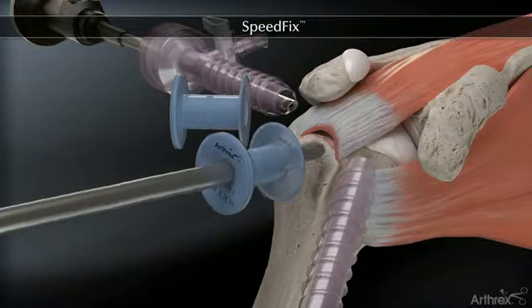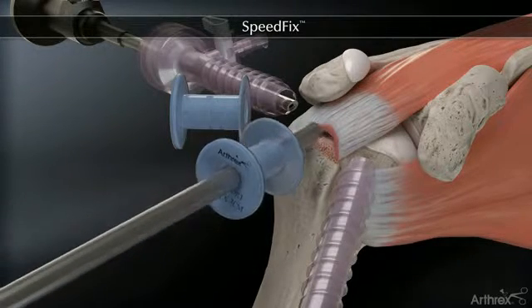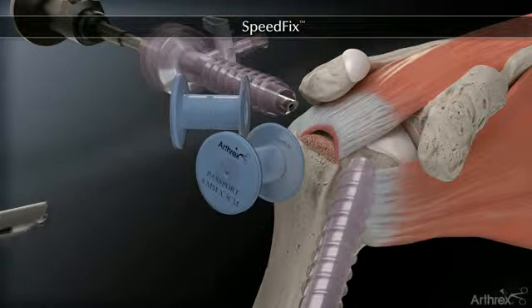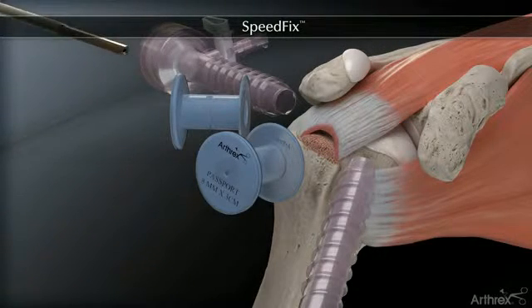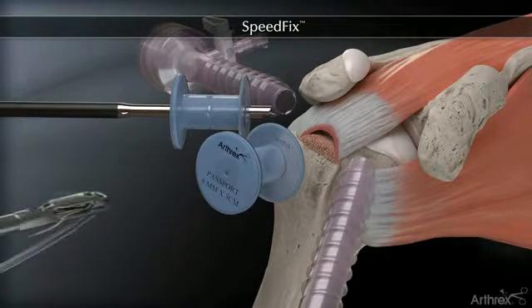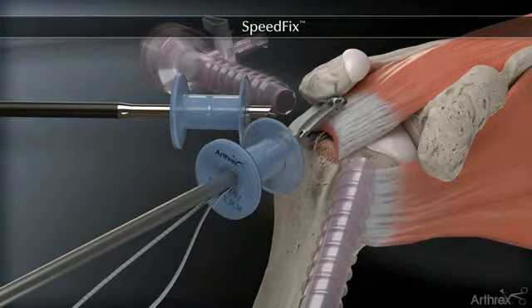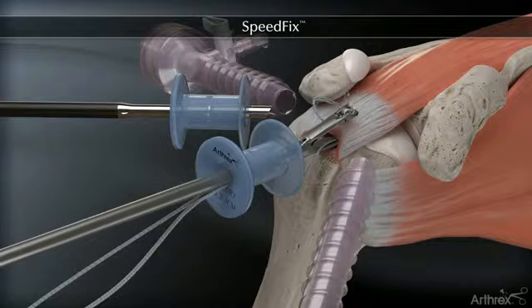The rotator cuff footprint is prepared. The Arthrex sheathless arthroscope is moved to a posterolateral viewing portal, and a multi-fire fast pass scorpion is used to pass the fiber tape in an inverted mattress configuration.